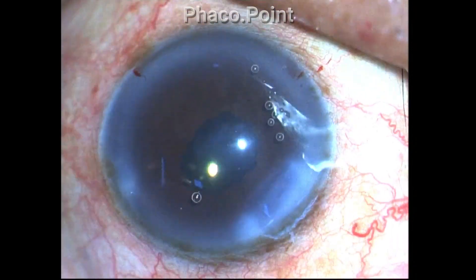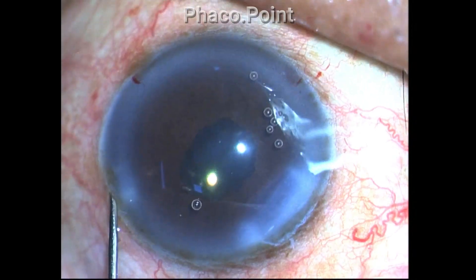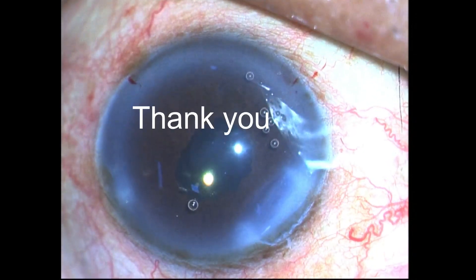I hydrate the incisions and that brings the case to an end. Thank you for your attention.